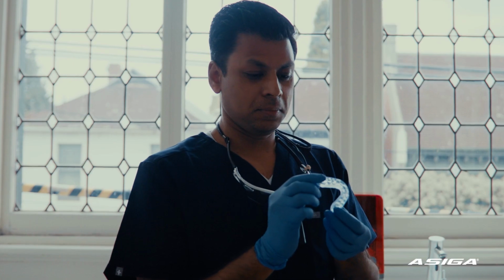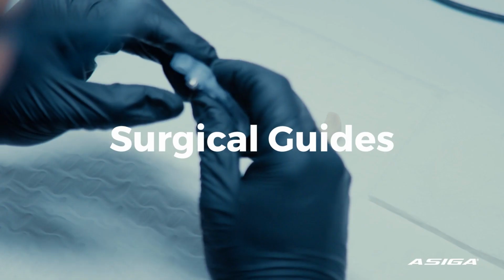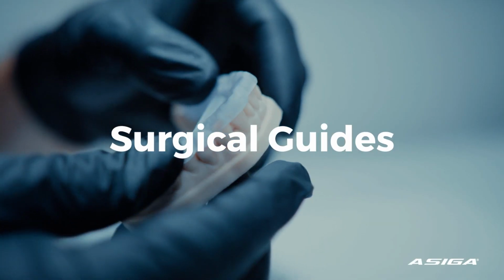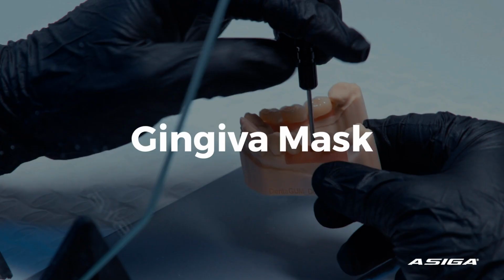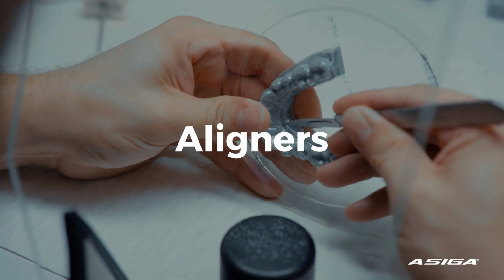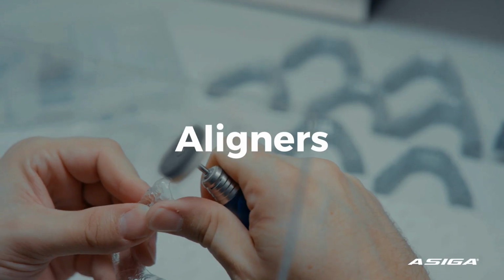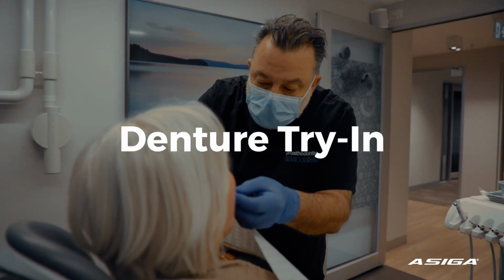The Asiga is an integral part of my whole workflow, so I definitely recommend it. Asiga's renowned for its accuracy. It just delivers exceptional quality. The consistency and the incredible build quality. You get multiple materials and multiple products with one printer. The level of fine detail and the quality is excellent. It just adds that added bonus to your patient experience. Asigas are literally just plug and play. It's fast, it's very, very reliable. It's the best printer that we've ever found.